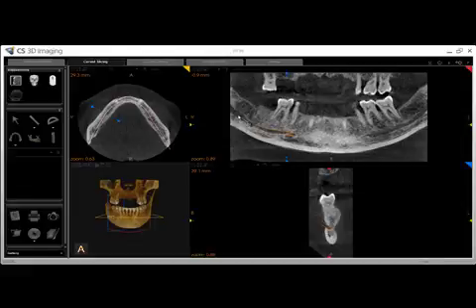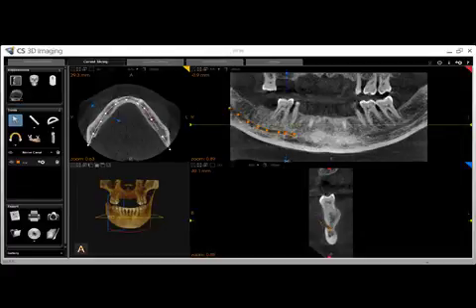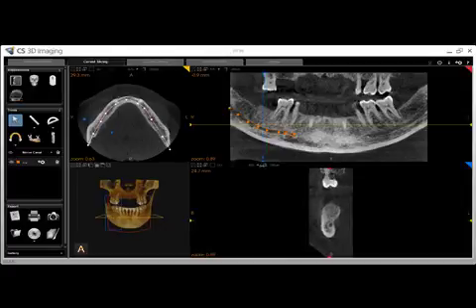You may then move through your tracing using the large blue ball or by scrolling your mouse wheel with your mouse hovered over the transaxial slice to check the nerve tracing. To correct a point, single left-click the orange movement node and drag it into position.